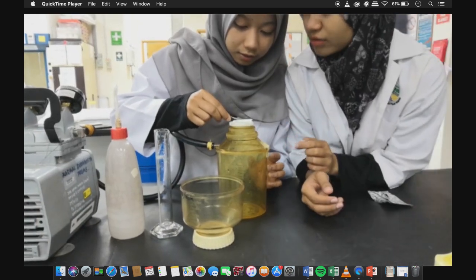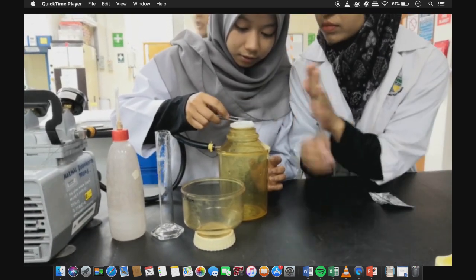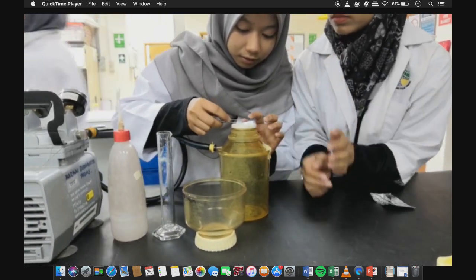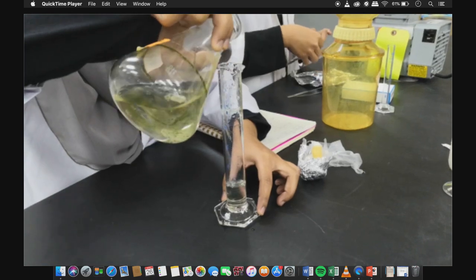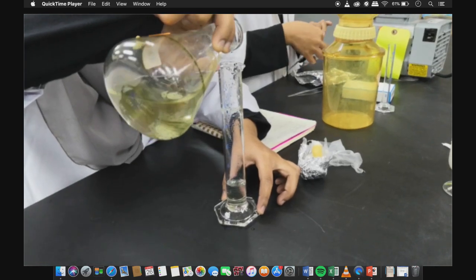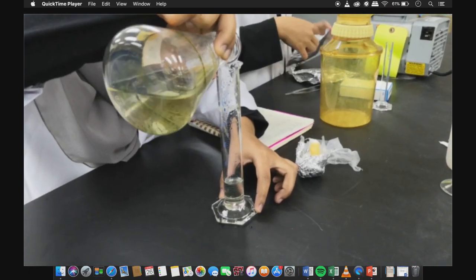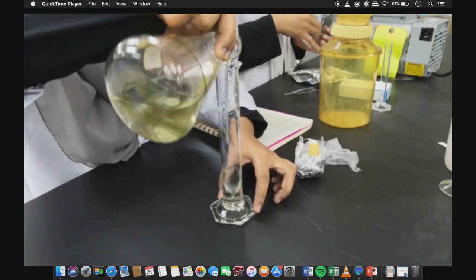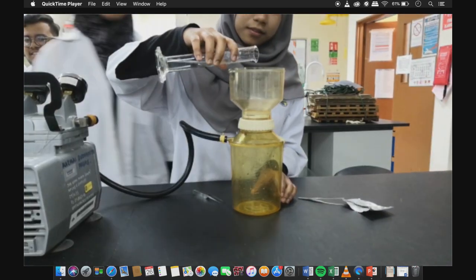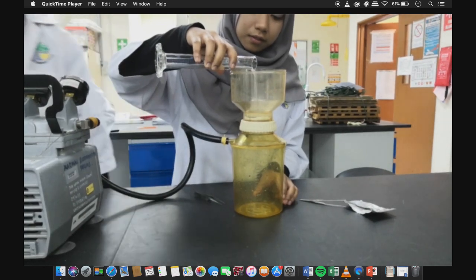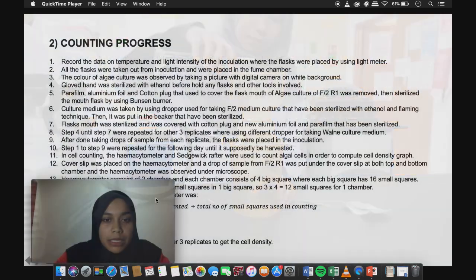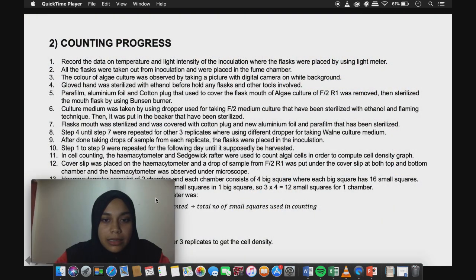Steps 4 to 7 were repeated for the other replicates, using a different dropper for taking Walna culture media. After taking drops of sample from each replicate, the flasks were placed back in the incubation.